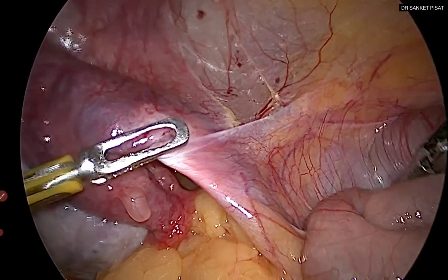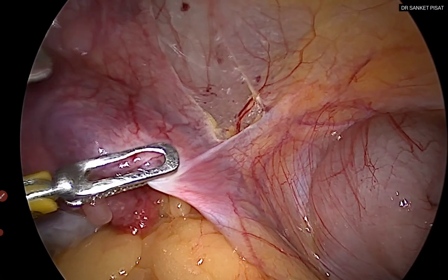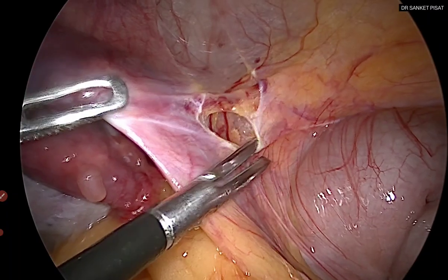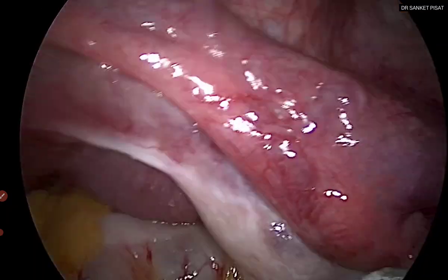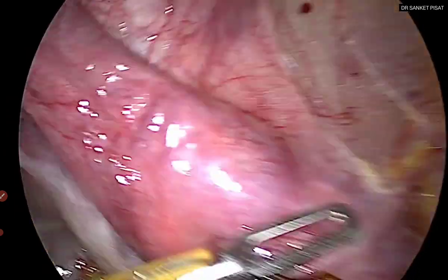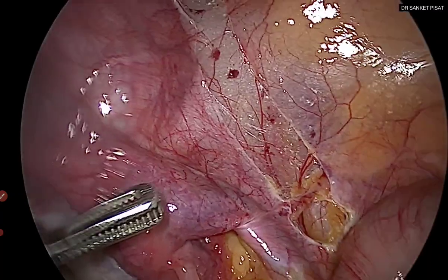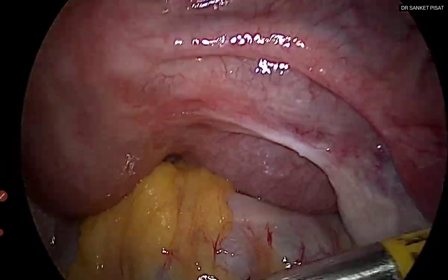We have reached up to the level of the round ligament. You may cut the round ligament or cut it at a later stage — it does not matter too much for the purpose of uterine artery ligation. We then come back to the previous incision and extend it further cranially, from the round ligament upwards until we see the body of the psoas muscle. With about 10 or 15 cases you will get an idea of exactly how much to extend the incision.